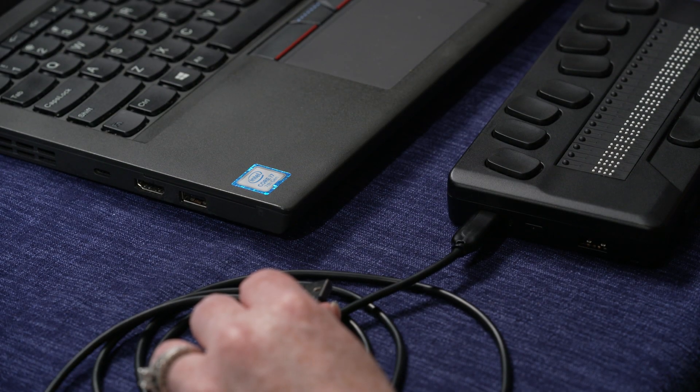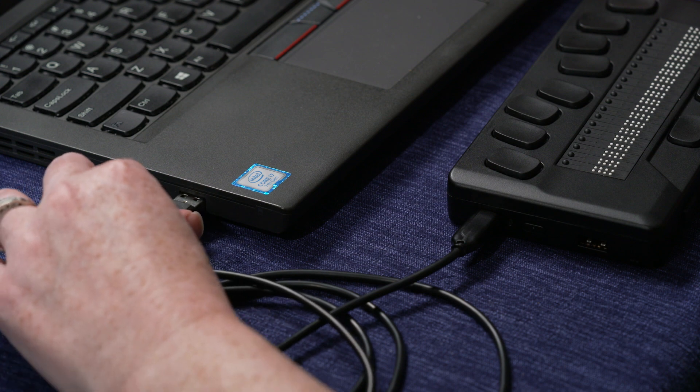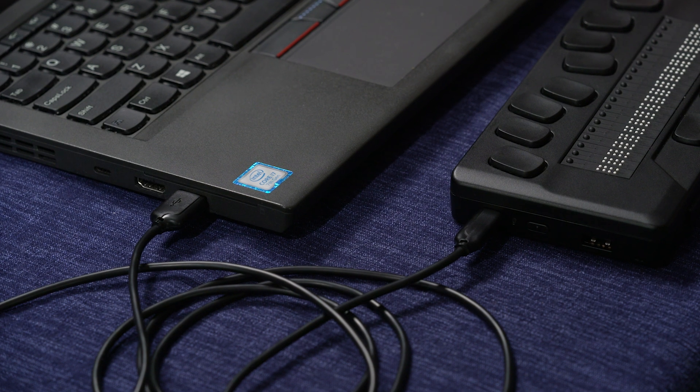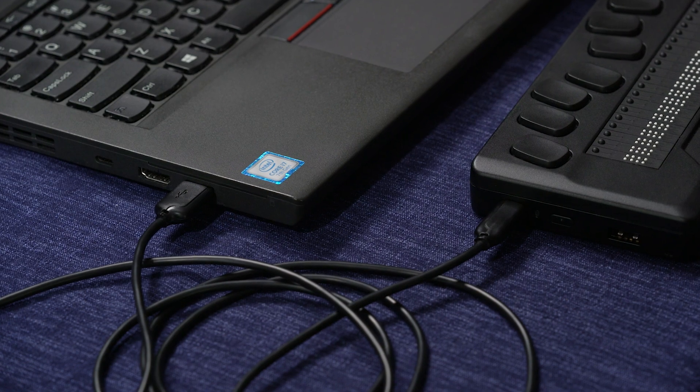Connect the eReader to the computer using the included USB cable. On the eReader end, you will be using the USB-C port, the smaller one near the back of the unit on the left side. On the computer end, use any available USB-A port.